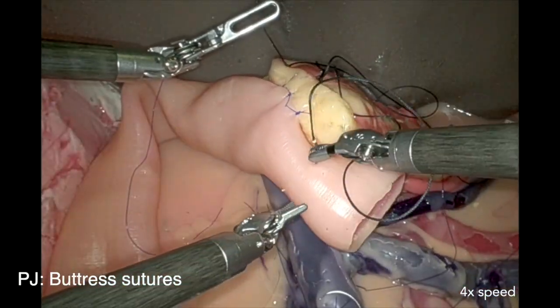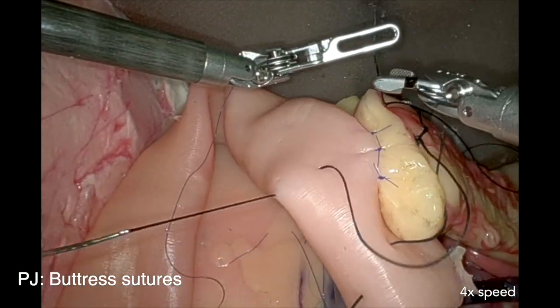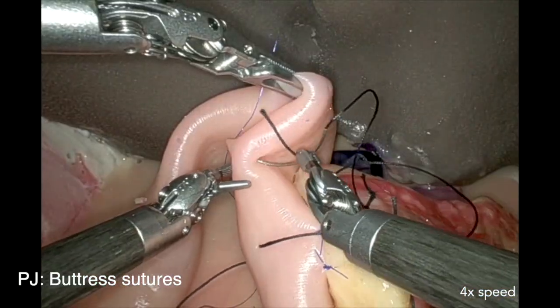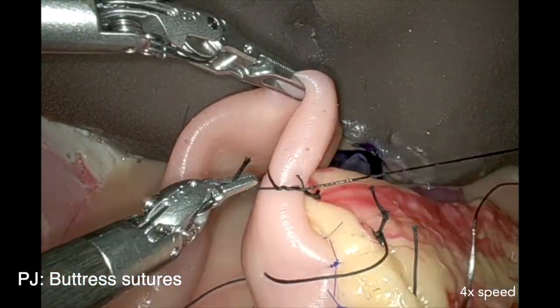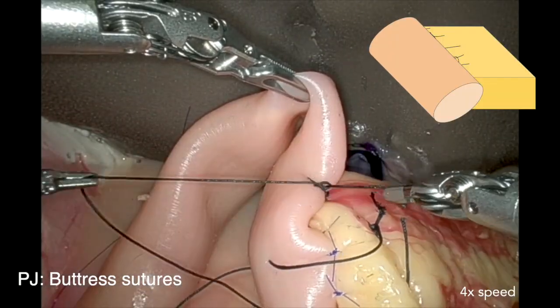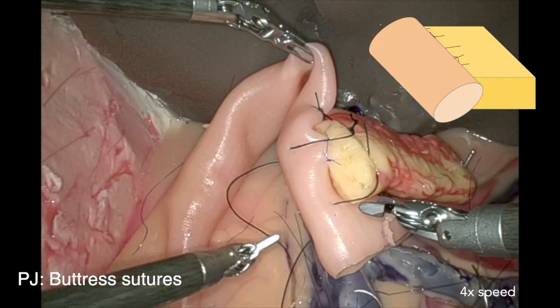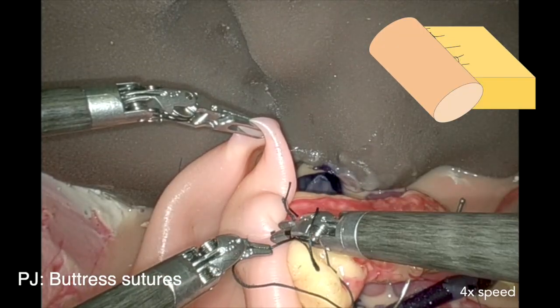In the next phase, we place the buttress sutures, and we aim to fold the bowel over the pancreas. Ideally, the bowel would fold over the pancreatic capsule anteriorly.